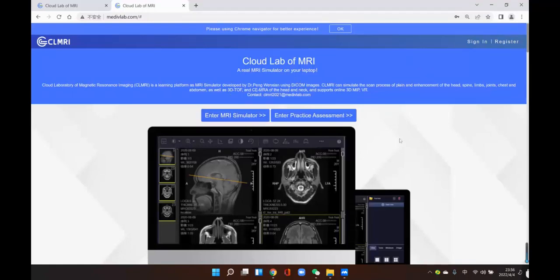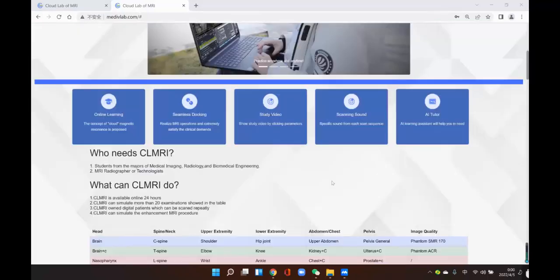After you practice in the simulator system, you can enter practice assessment to test yourself. After the test, the assessment system will give you an assessment report automatically and point out what problems there were with your test.